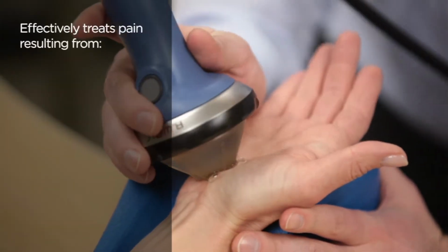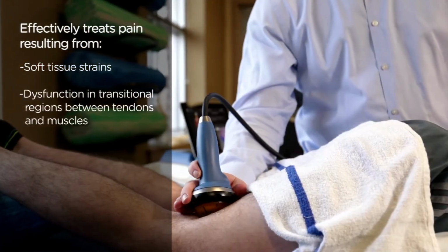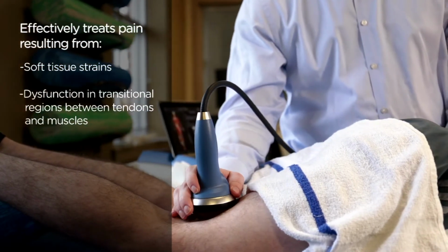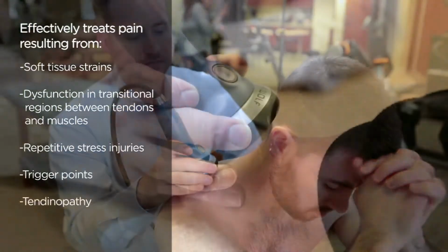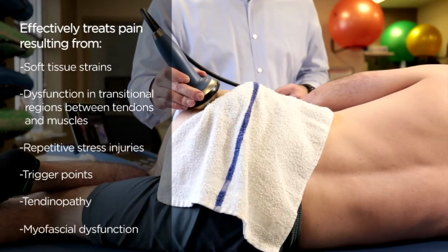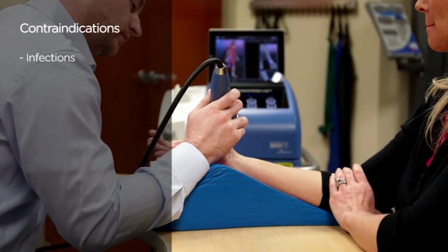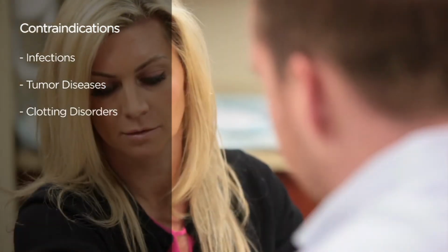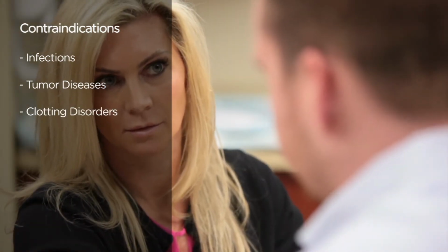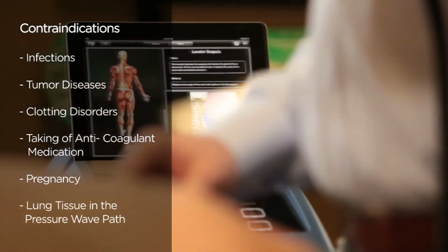sound compression, including soft tissue strains, dysfunction in transitional regions between tendons and muscles, repetitive stress injuries, trigger points, tendinopathy, and myofascial dysfunction. The primary contraindications are infections, tumor diseases, clotting disorders, where it's necessary to check the blood clotting status before treatment, taking of anticoagulant medication, pregnancy, and lung tissue in the pressure wave path.